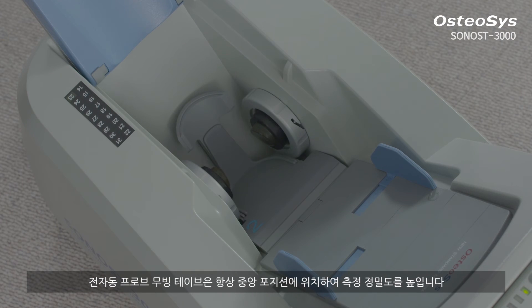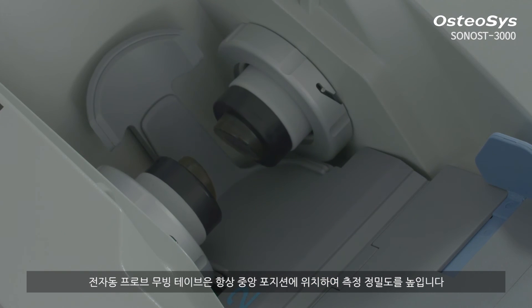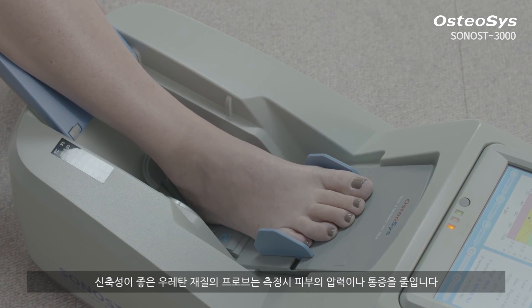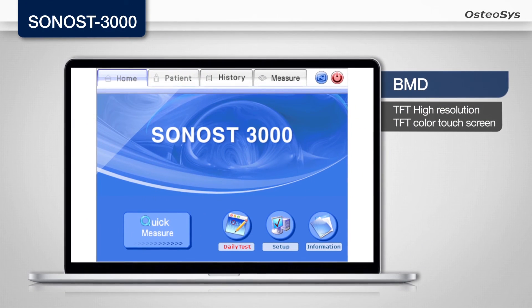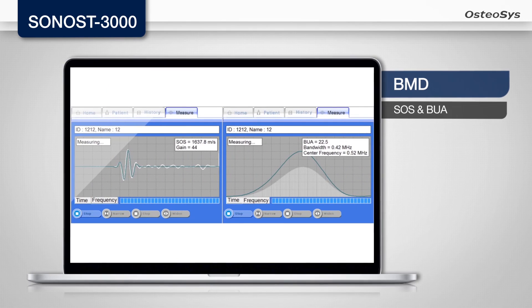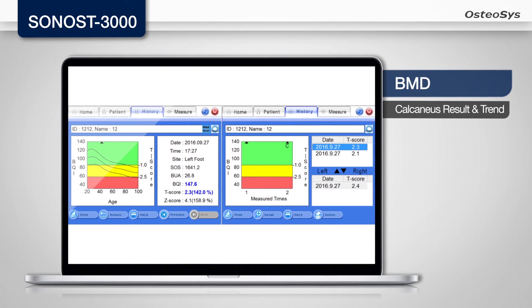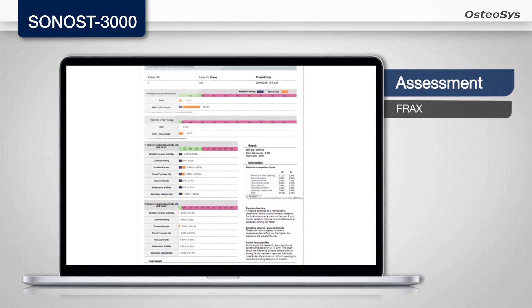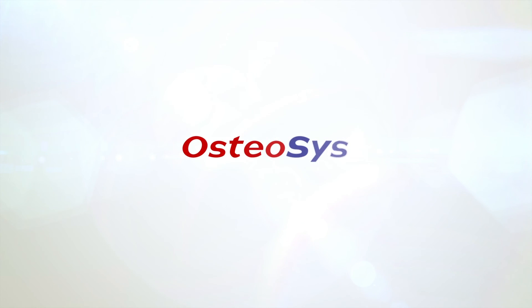An automatic moving probe table also situates itself in the center position so that it enhances the accuracy of a measurement. The soft type of urethane probe decreases pressure or pain on the skin during an examination. Better products for better life — Osteosis.